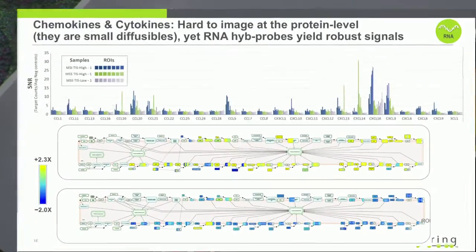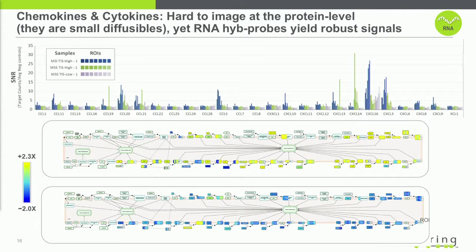And then when I was looking at why one region, the invasive margin, is hot and the other one is cold, all I did was dial up all the chemokine and cytokine mRNAs that I have in there. And this gives you an idea. This is a little window into the chemokine environment of those 2 particular regions of that colorectal tumor.